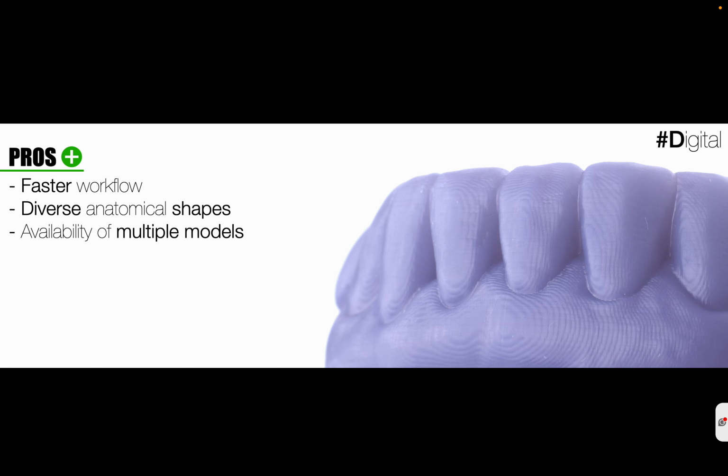We can do a mock-up and wax-up in a faster way compared with the conventional. Then we can select different libraries. Different libraries means different tooth shapes, and you can choose the ideal shape for the patient without investing a lot of time. And also we have the possibility to produce different models.